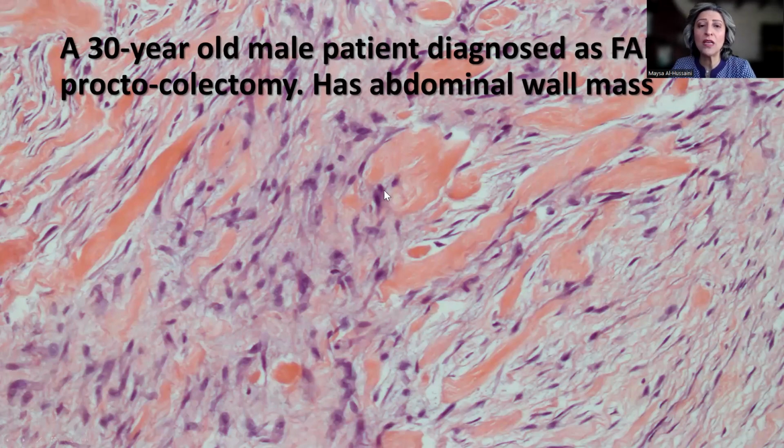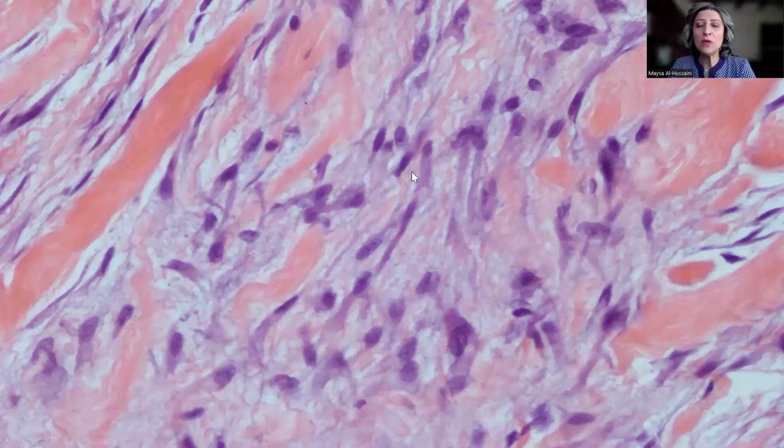So we have really proliferation of spindle-shaped cells with the formation of abundant collagen, and usually the spindle cells do not really touch each other. They are in a way separated from one another. There might be some degree of minimal pleomorphism, but certainly not more than this, and very occasional, if ever present, mitotic activity.